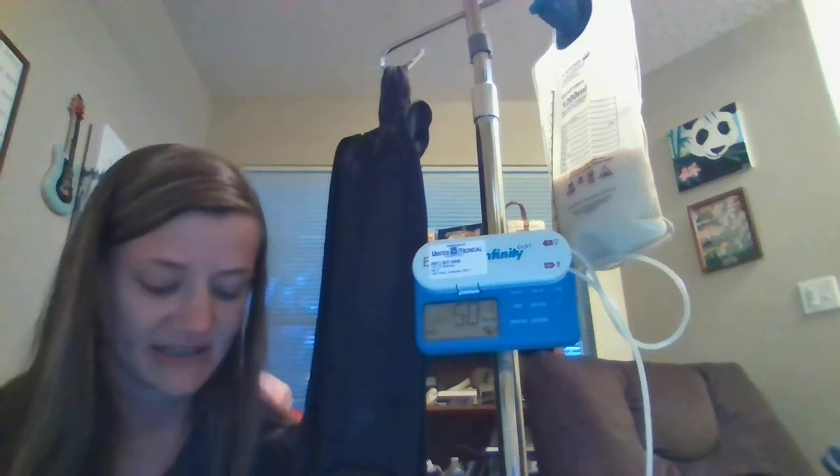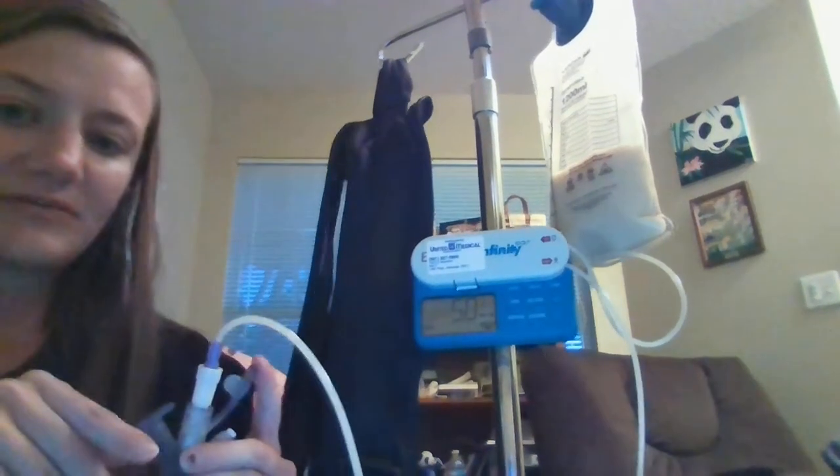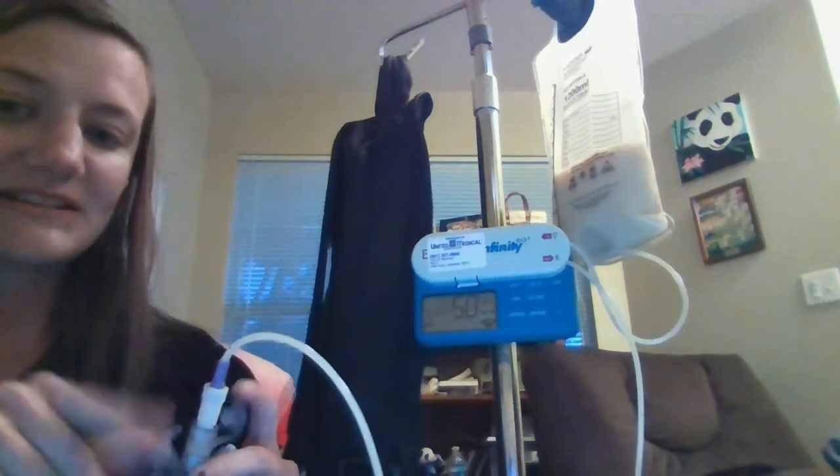I do. I've actually been doing my feeds mainly at night now because I don't like wearing this during the day. I just get stared at a lot, and I don't like that. And it's also hard to keep from pulling it out, because I've pulled it out so many times in my car. I've made lots of messes. I've pulled it out shopping before. It's not fun at all, especially when digestive juices leak all over everything because you pulled it out. I didn't close the little cap thing, which is this thing. You have to close this when you take this out.